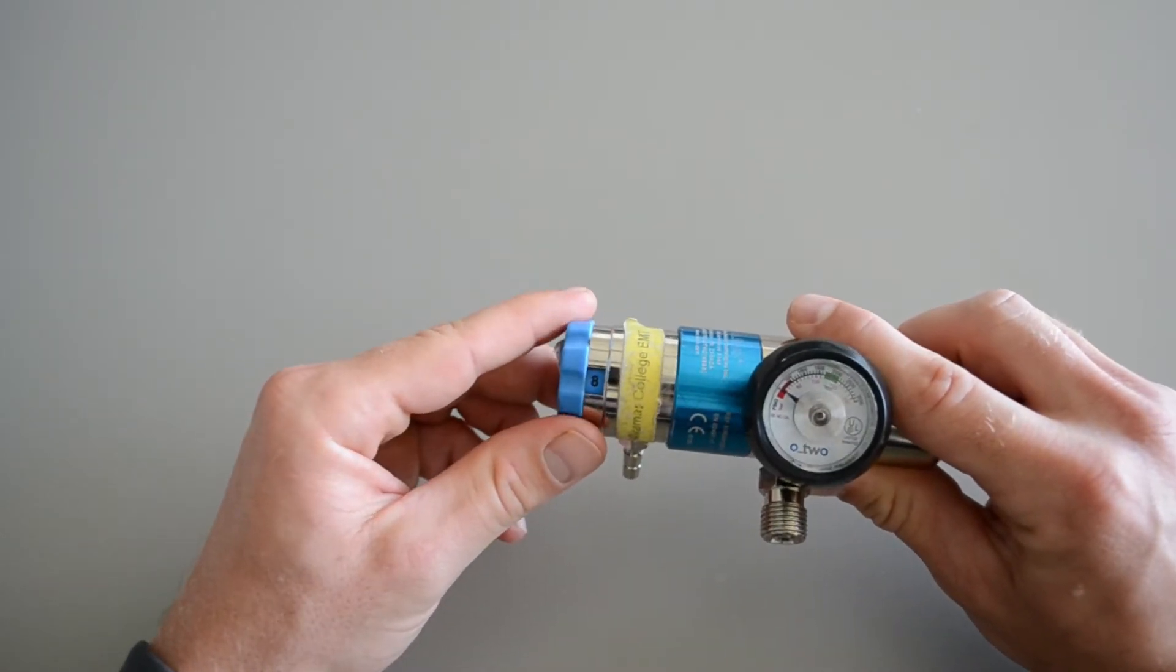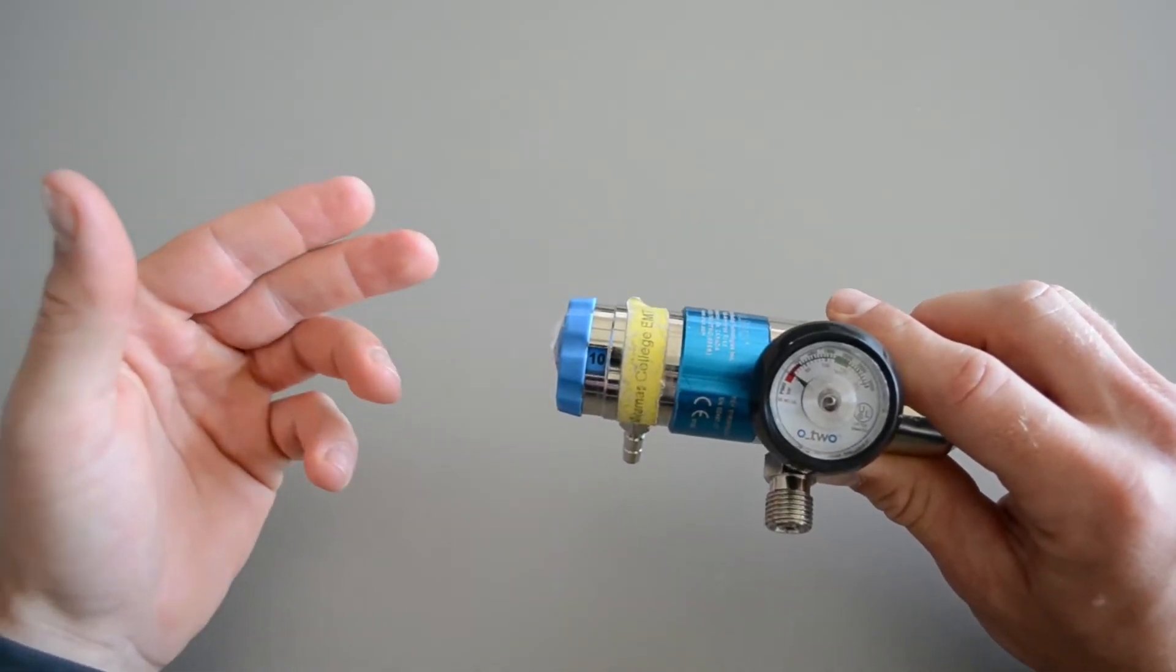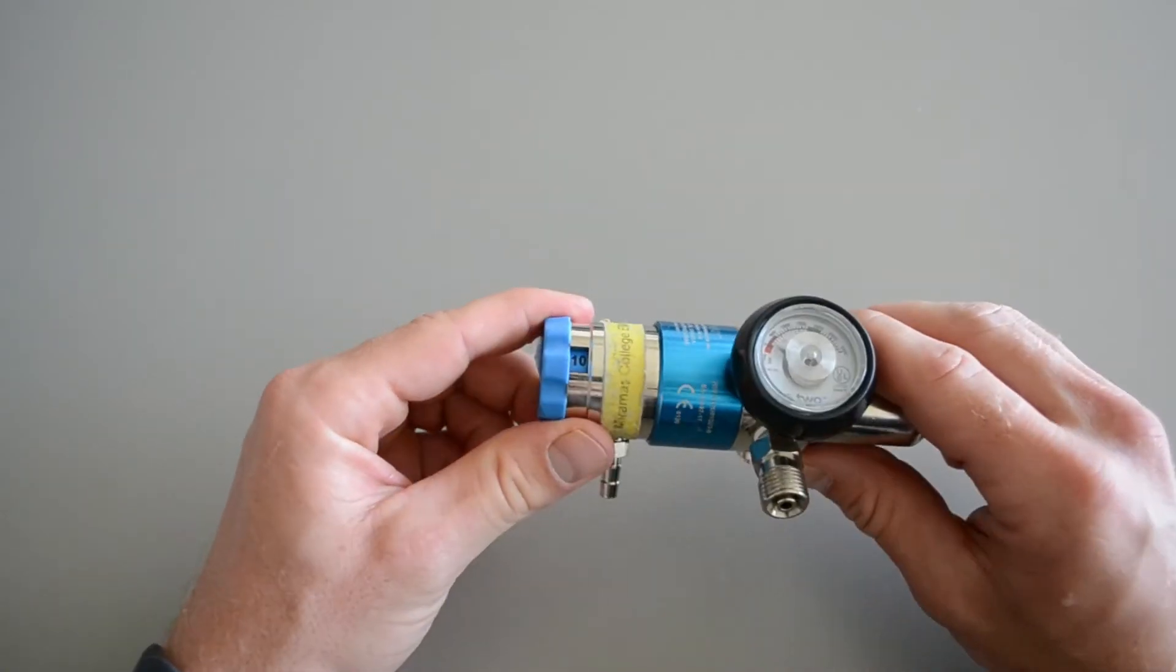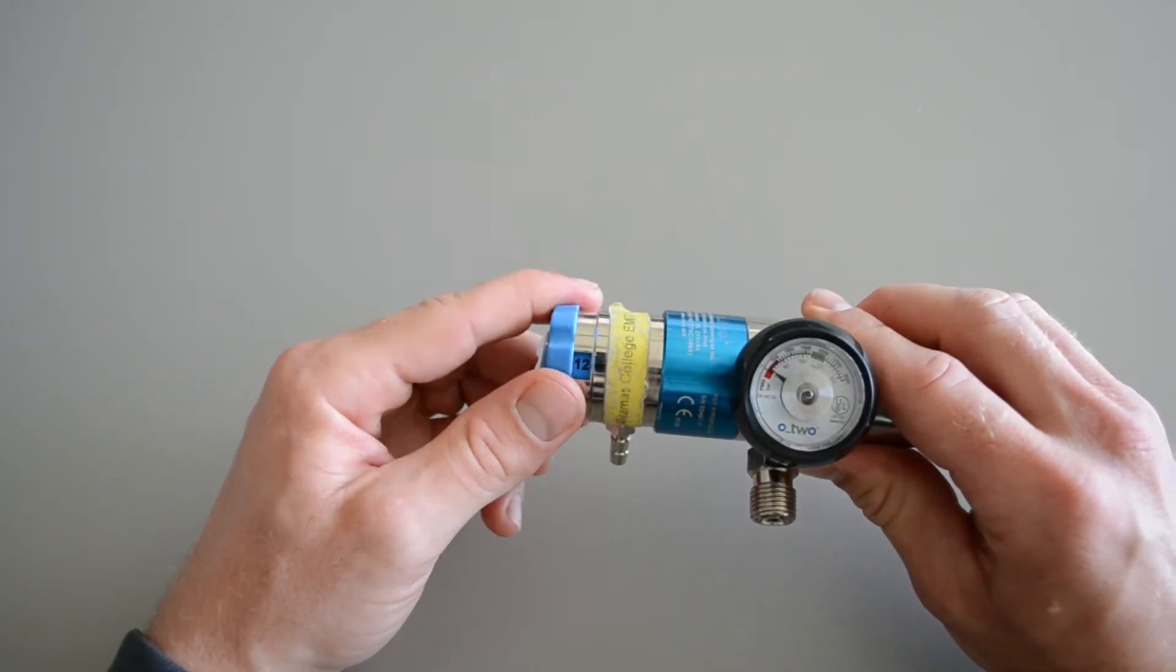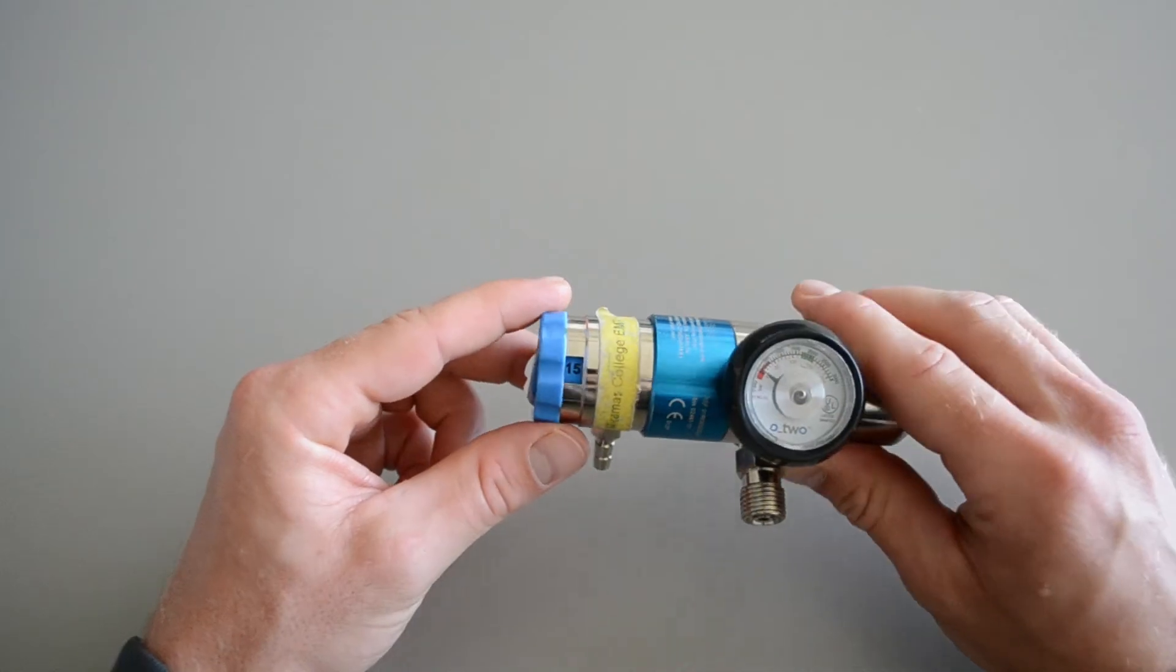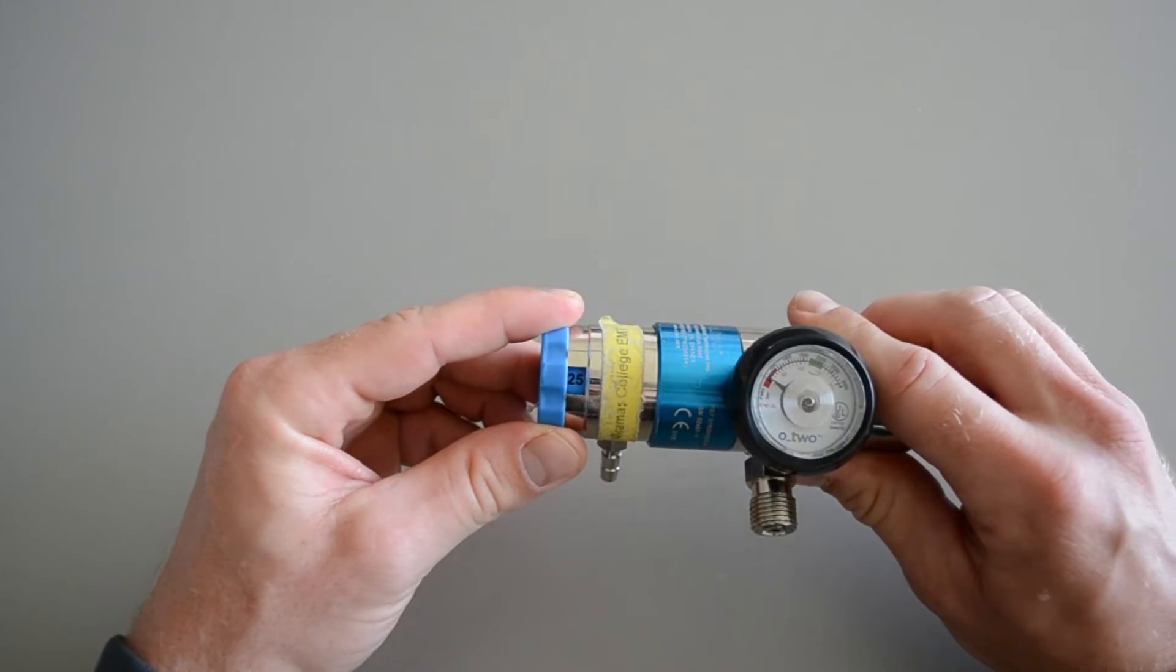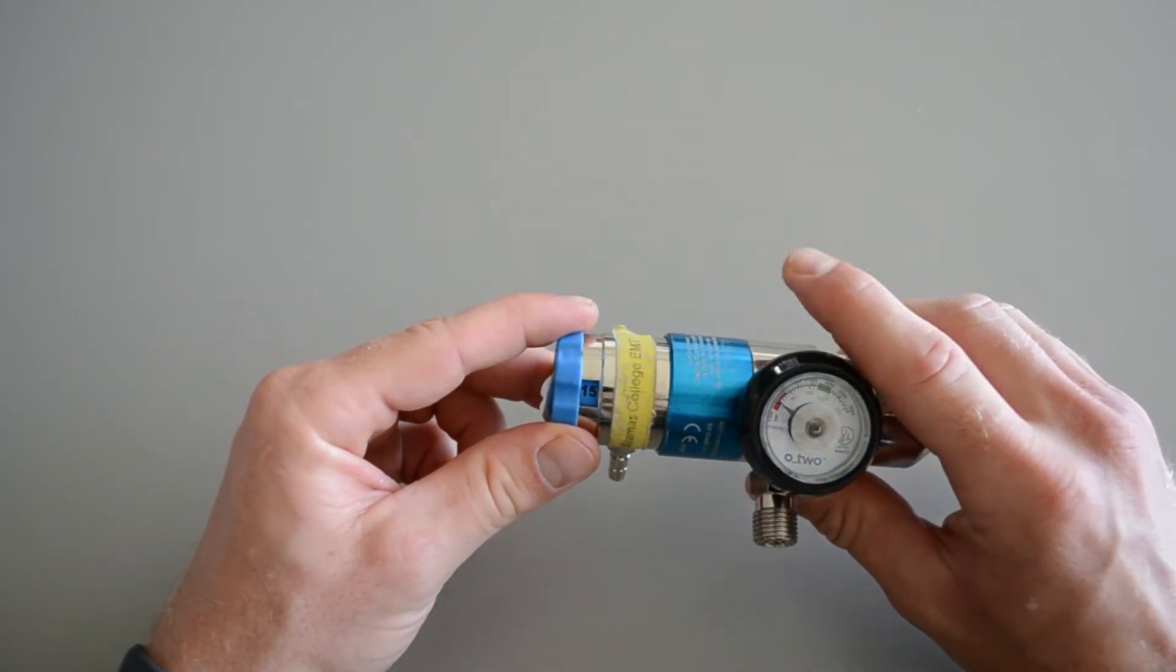8 liters a minute you might use with a nebulizer, 10 liters a minute, that's where we start with our non-rebreather mask, and then it jumps to 12, followed by 15. 15 is also the setting you'll use for BVM. There's additional settings, 20 and 25, don't worry about those, we do not use anything above 15. 15 is the max.